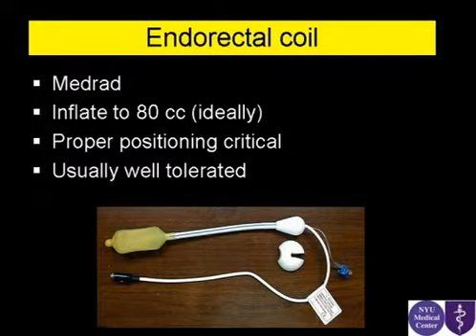So this is important to connect it to get signal from the anterior portion of the prostate when you're using conventional imaging. And this is something that can stop it from moving, basically. And usually you use 80 cc's of air, and positioning is extremely important.